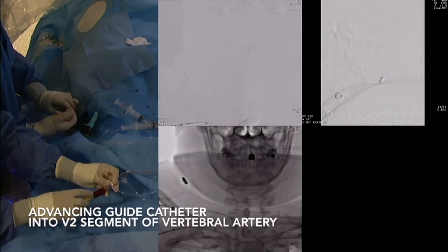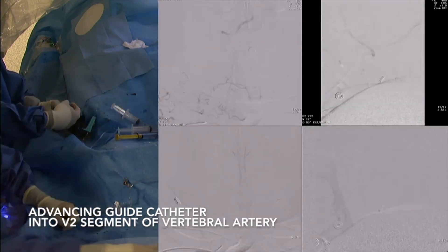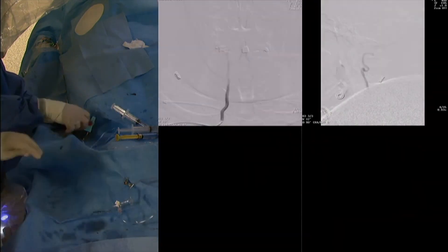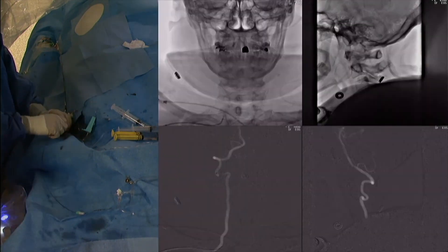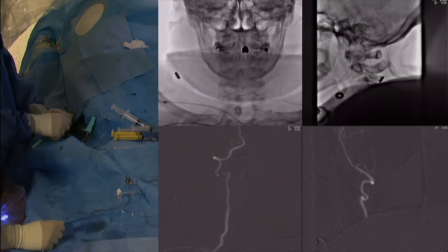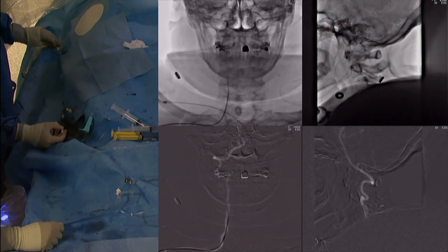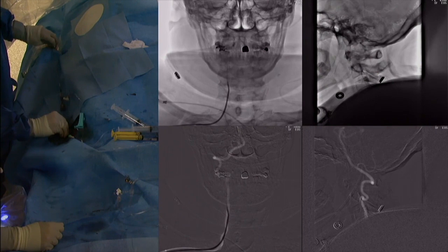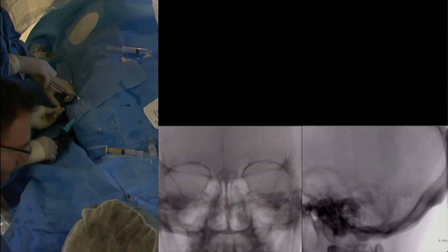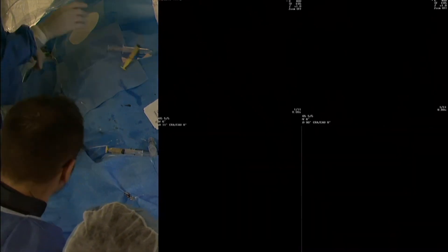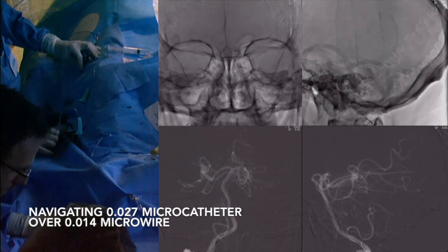Once we've accessed the radial artery and navigated the catheter into the subclavian artery and up the vertebral artery, we now have stable guide position for attempts to flow divert this complex PCA aneurysm. As is shown here, the wire is maneuvered into the distal cervical vertebral artery, over which we advance our guide catheter. Our guide catheter is temporarily parked in the mid-cervical vertebral artery, through which we now bring a microcatheter over a microwire.